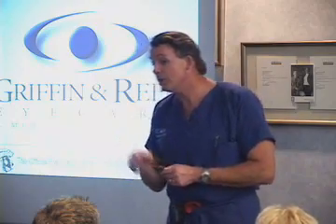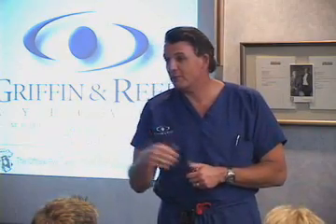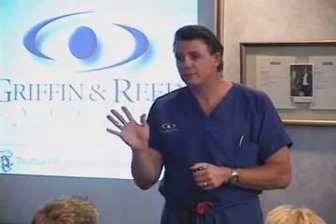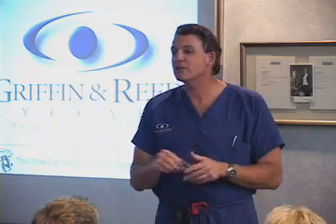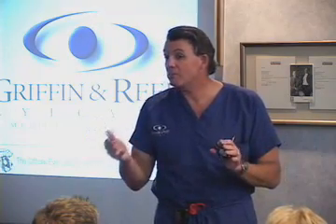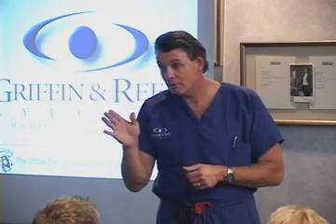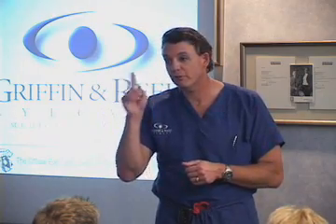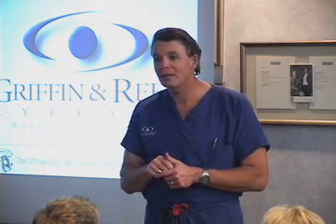Now, people that do plug and play, that shove the numbers in and do the treatment based on what the laser tells them, they're going to tell you you've got to do custom. It's the difference between high definition TV and regular TV, and that's baloney. What it is, it's the difference between 50 to 70% outcomes and 90% outcomes if you plug and play. Because plug and play is much better with custom than it is with standard. Okay, custom's much more accurate for plug and players, and so they're going to tell you you got to do the custom. But what you're really doing is paying to reduce the redo rate by about 18 to 30%. And I don't think you need to do that.